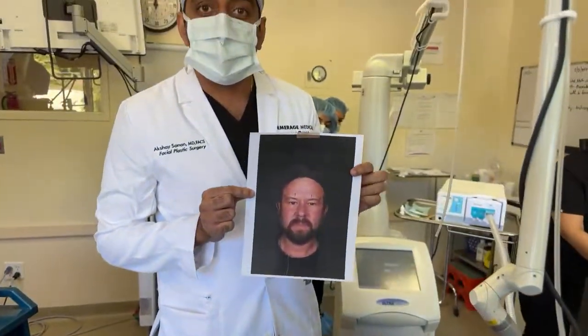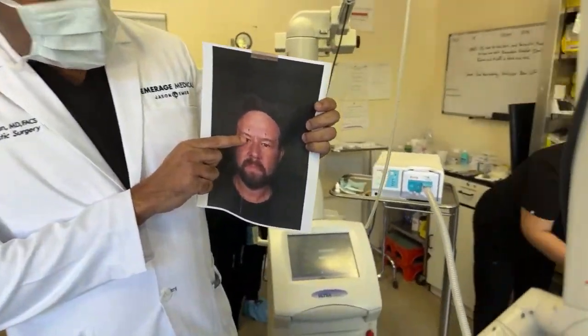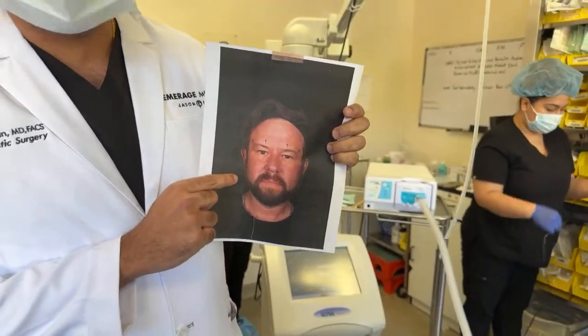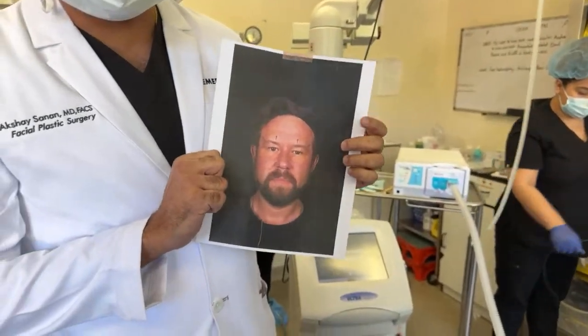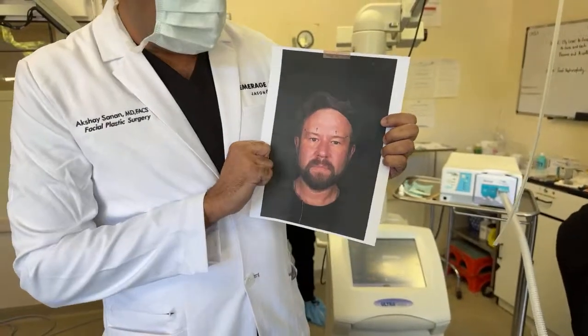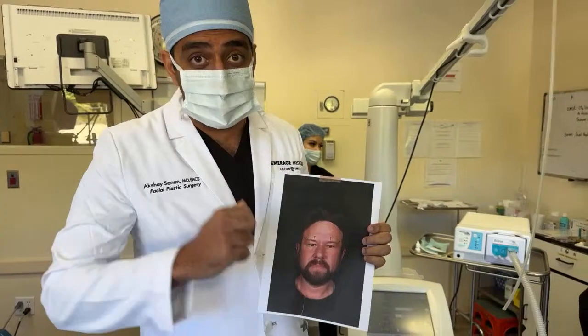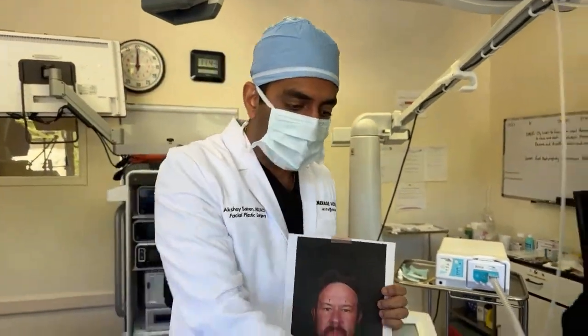So this is where we started this morning. His eyebrows in the middle and the corner, look how low they are in the middle. So even though he's a young, vibrant person, he always was being told he looked tired and angry. So we did an endoscopic brow lift. The incisions are hidden in the hairline. There's a couple up in the hairline. You can't even tell, honestly.